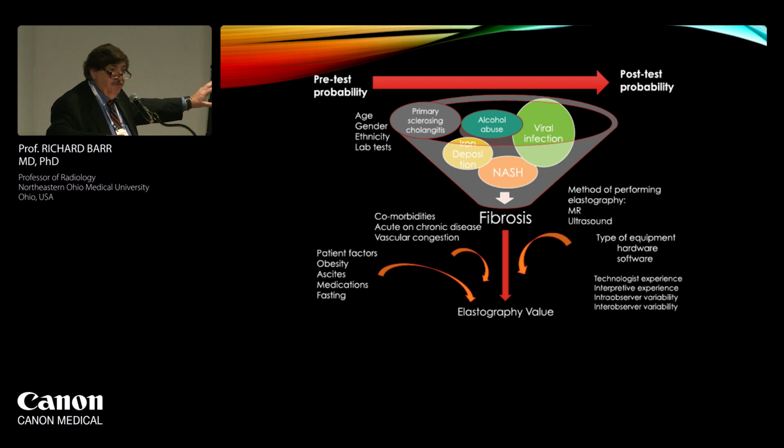It's important to remember we never measure fibrosis, we measure stiffness. And stiffness is a combination of fibrosis, inflammation, and congestion. So if you ever have a patient that has more inflammation, someone that's on alcohol, someone with acute hepatitis, the values are reflecting the inflammation, not so much fibrosis. The same thing with somebody with right heart failure.